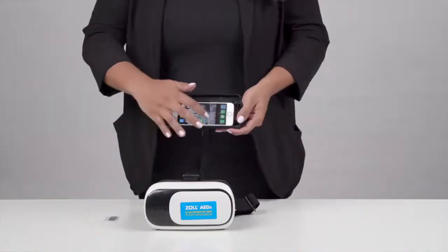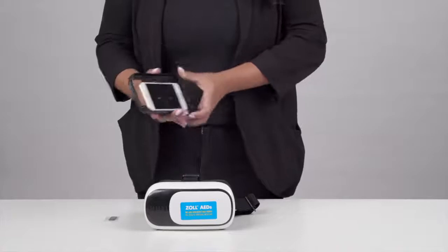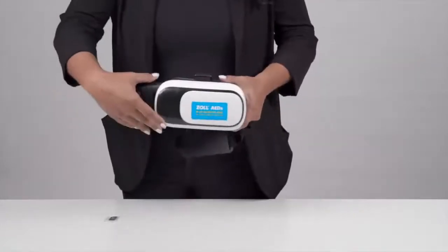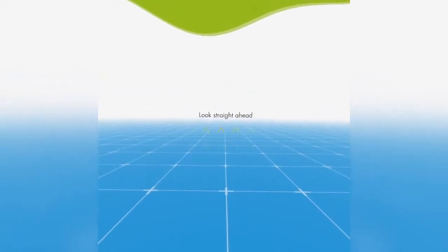Place the phone in the holder of the cradle, activate the phone, and then select the ZOLL VR app. Insert the phone into the goggles with the screen facing you. Once the app has completed loading, the screen will instruct you to gaze at the center of the screen. When you look at the center of the screen, an orange circle will appear, indicating the app is starting.